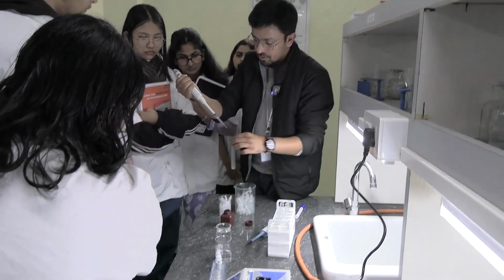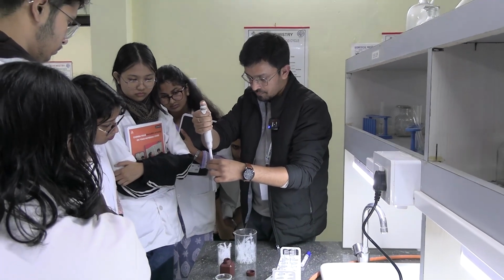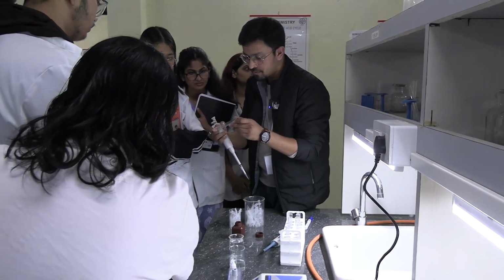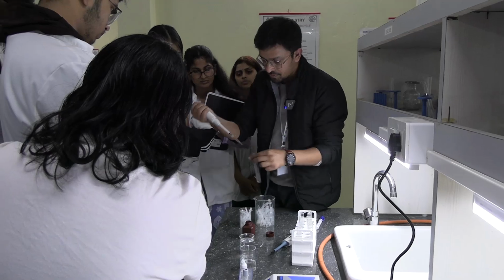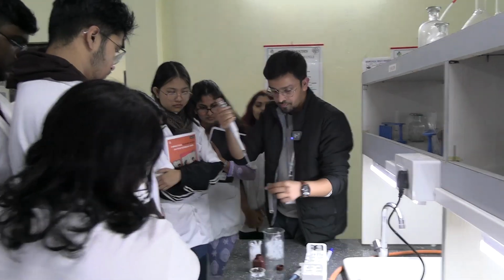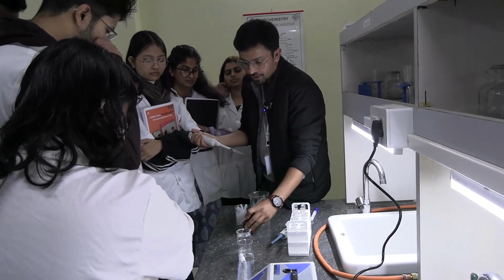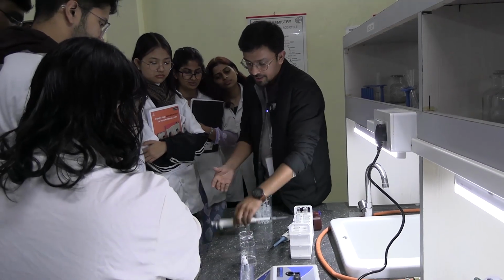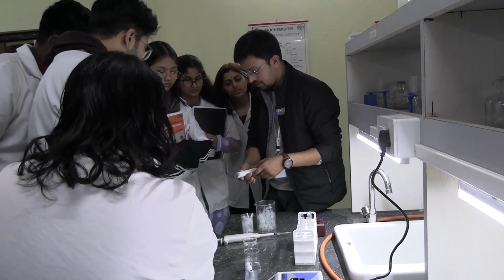Take the sample, put it inside the test tube. Done? Take the standard. Take the sample. Done. 3 samples. Fine. Now this enzyme reagent part is over. Okay. Now I have to add the 3 samples. In the blank I will be adding distilled water. That is around 10 microliters. So how much have I fixed it over here? 10. Right?